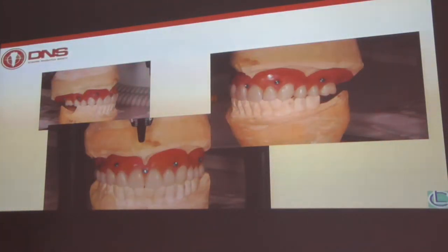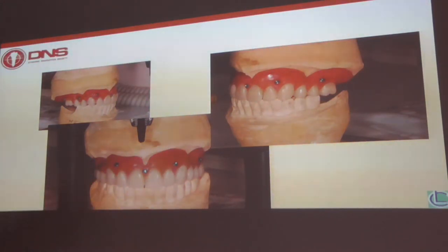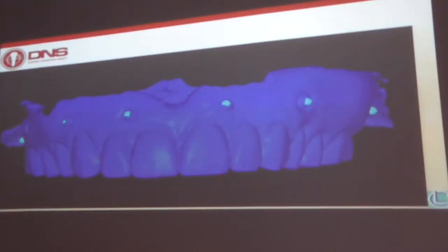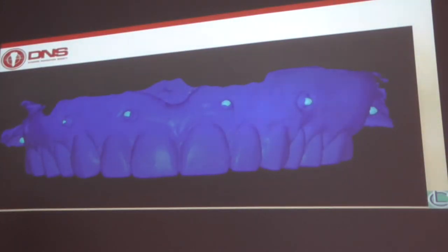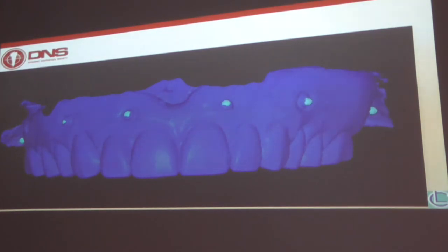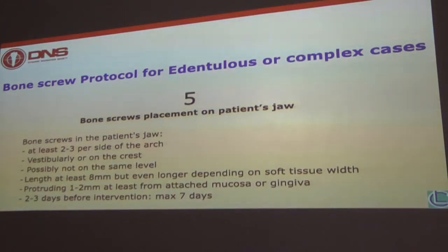I'm checking in the models how the discrepancies are from the two jaws. Then comes the fourth point: bone screw placement. First on the wax-up, because you can scan it with intraoral scan and use these landmarks in the CBCT. First place the bone screws on the wax-up. For size: you can choose 6mm, 8mm, 10mm, 12mm — whatever you like. I use 6mm for dentures, but for intraoral placement 8mm, 10mm, or even 12mm is better.